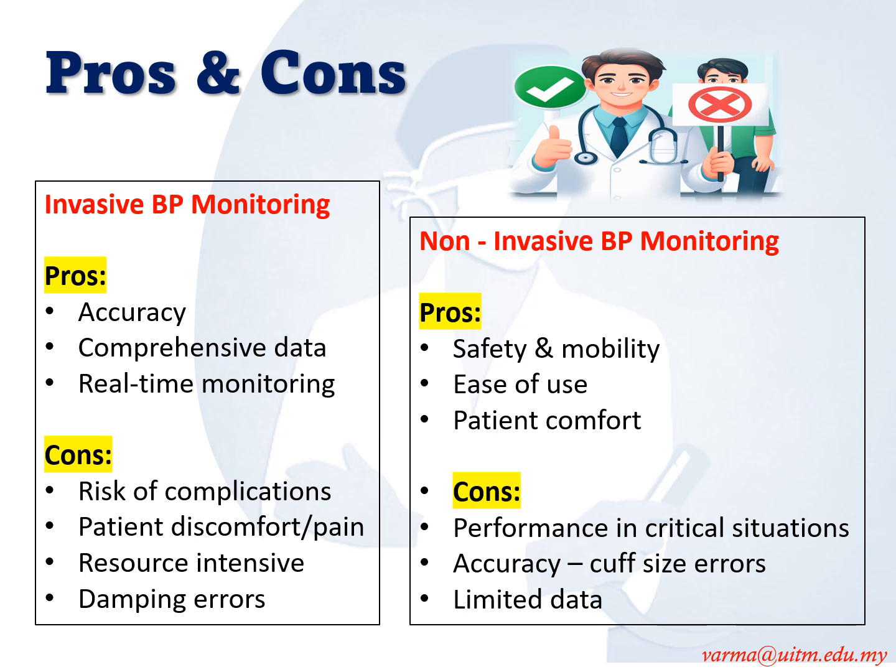However, in non-invasive blood pressure monitoring, performance is very questionable in critical situations, in patients who are in shock, patients in the ICU setting or under anesthesia. And because the choice of cuff is very important, and that can lead to cuff size errors, the accuracy is questionable. And next, limited data is obtained from non-invasive blood pressure monitoring.